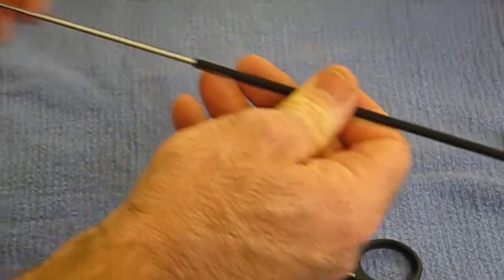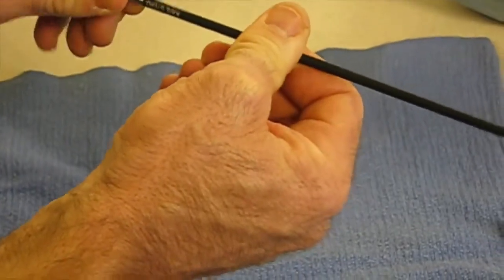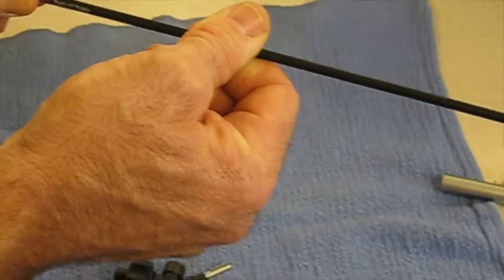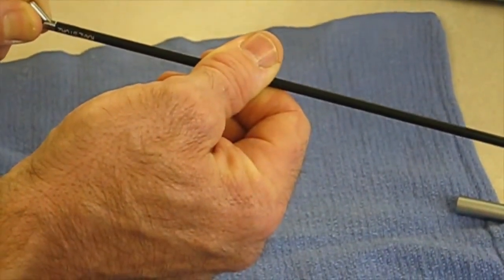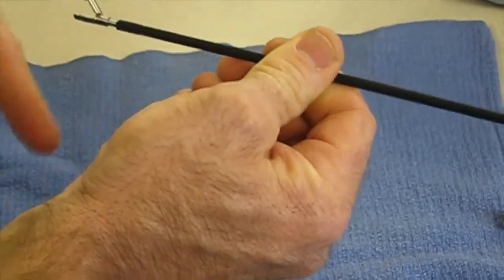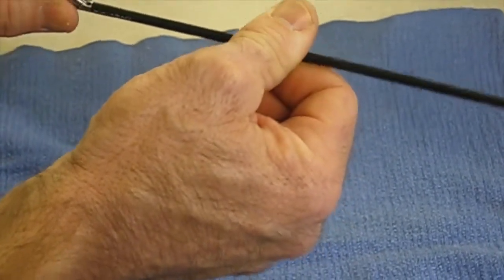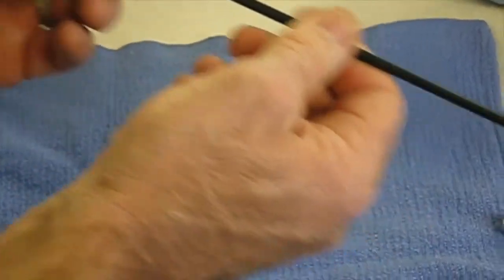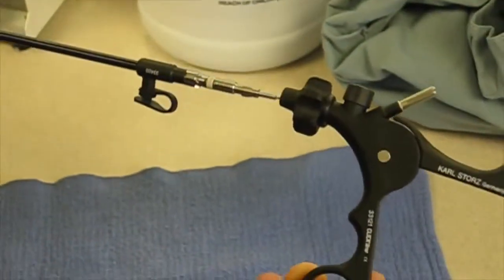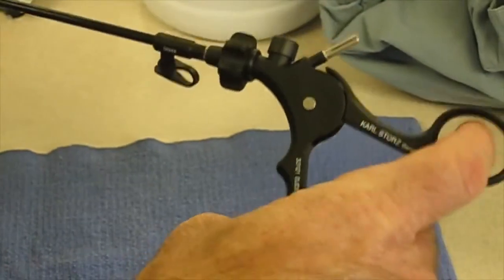inside the insertion tube. You slide it in. Make sure you lock it on. Once it's locked on, by turning a quarter turn clockwise, you shouldn't be able to pull the jaws back out. If you don't lock it, it won't connect properly to the handle. So you turn a quarter turn, it's locked on. Hold the bottom handle, slide it onto the forceps, squeeze, and now it's connected and working properly.